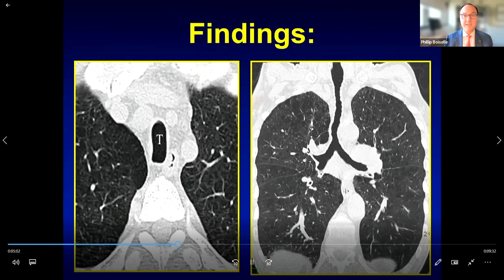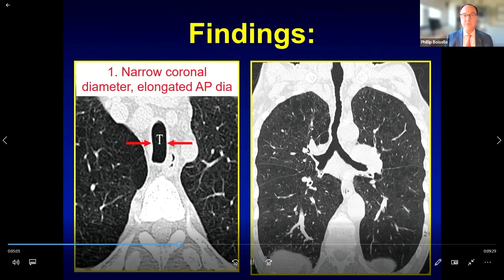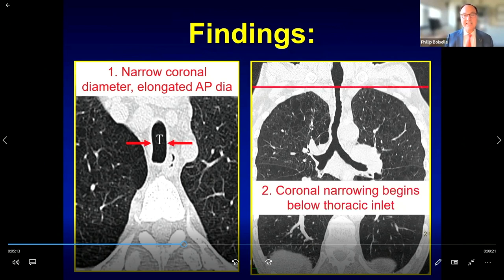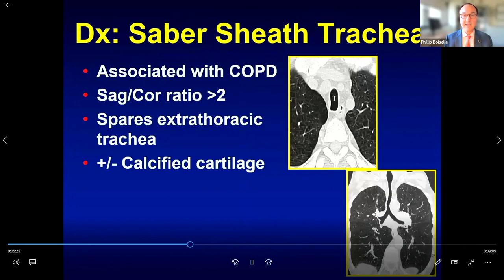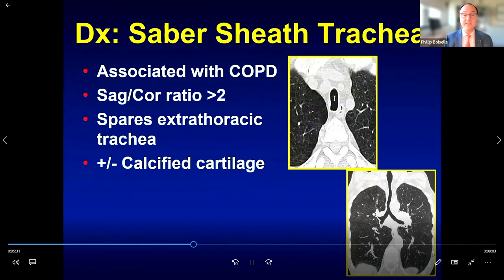On the axial image we see a narrow coronal and elongated AP diameter. The coronal image shows the intrathoracic trachea is diffusely involved with sparing of the extrathoracic trachea. This is a saber-sheath trachea, strongly associated with COPD, and it characteristically spares the extrathoracic trachea.